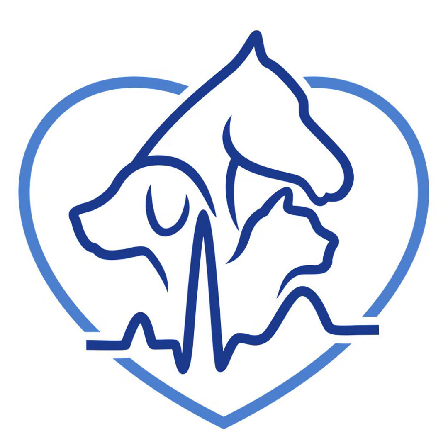So we create multiple maps with and without contrast, T1 and T2. You can also do a T2 star map, which helps you look for iron overload, which is not something we've ever practically seen, so I don't routinely do that one. But we do T2 all the time to look for edema.